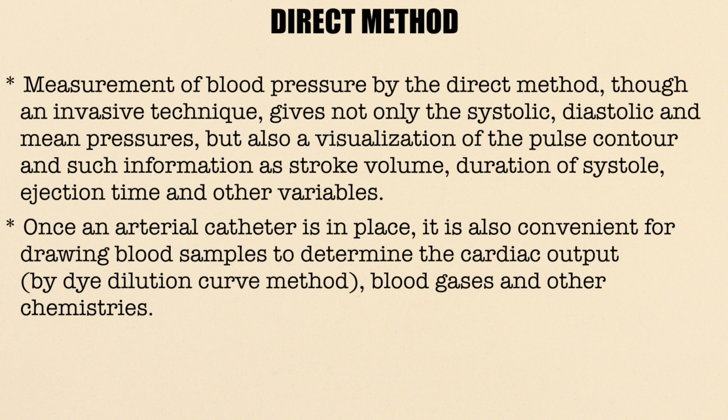Once an arterial catheter is in place, it is also convenient for drawing blood samples to determine the cardiac output, blood gases, and other chemistries.